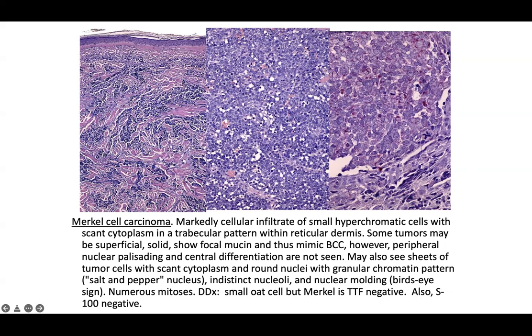The cells are small but very hyperchromatic with scant cytoplasm — the nuclei are what stand out. You can see speckled chromatin. If you perform CK20 staining, it shows a perinuclear dot pattern. Merkel cell carcinomas are CK20 positive in most cases, though there are rare exceptions with aberrant dedifferentiation. For test-taking purposes, CK20 is your money stain.